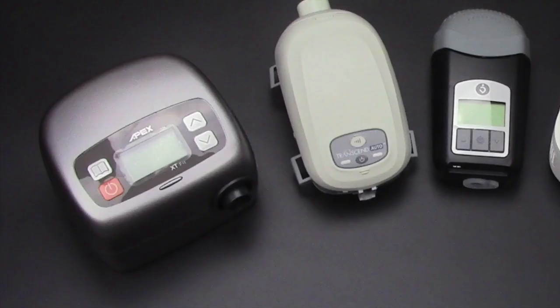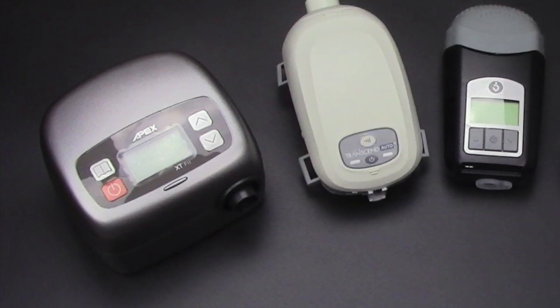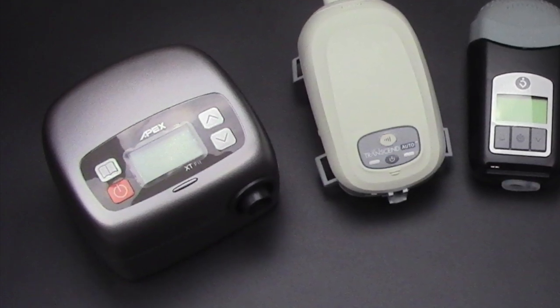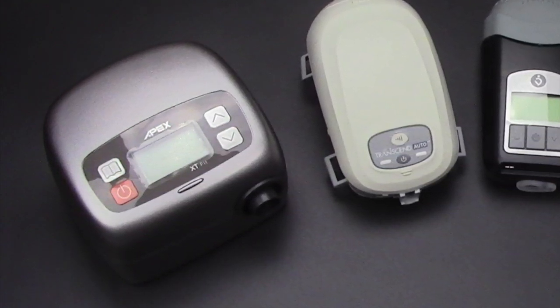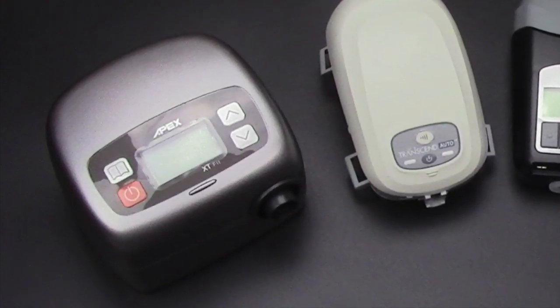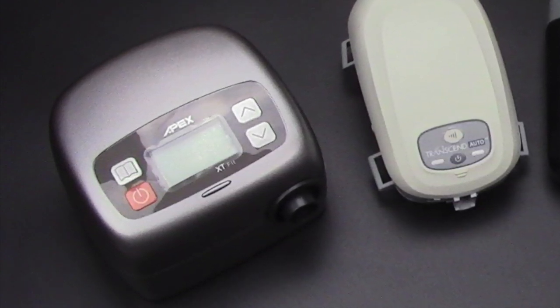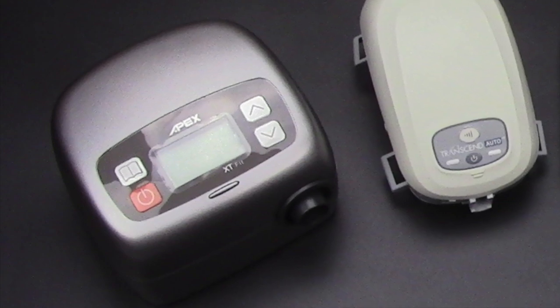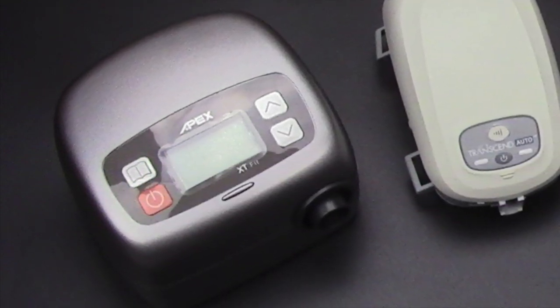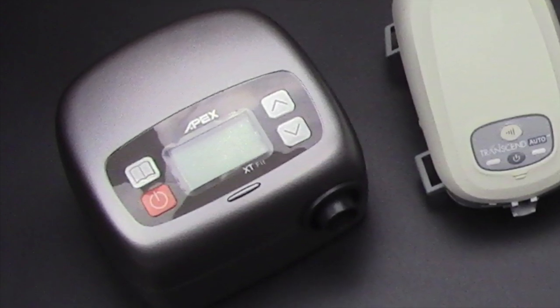Another thing to keep in mind is that some machines that have an internal power supply won't have a battery option, nor will they have a DC outlet option. What you would have to do in that case is get an inverter, a DC to AC inverter. Essentially it's a cable with a wall outlet plug coming off of it that you then plug your machine into. A prime example of this would be the XT Fit by Apex. The only power option would be an inverter.